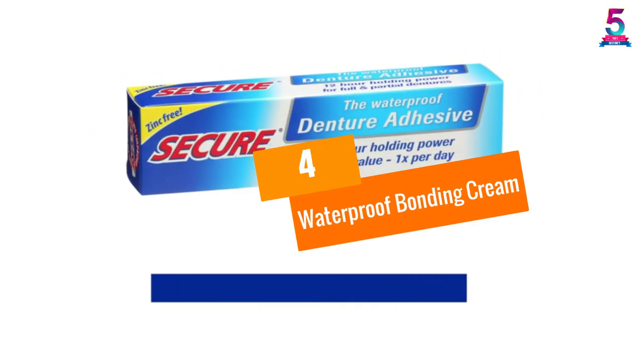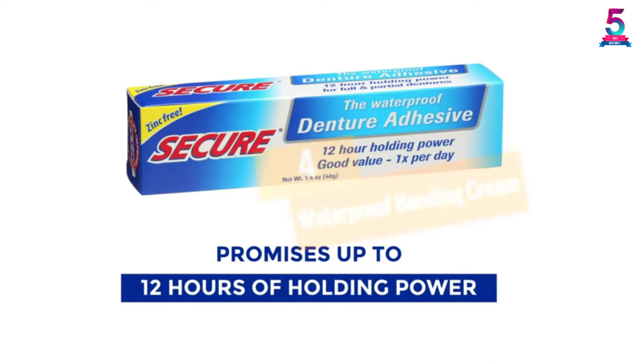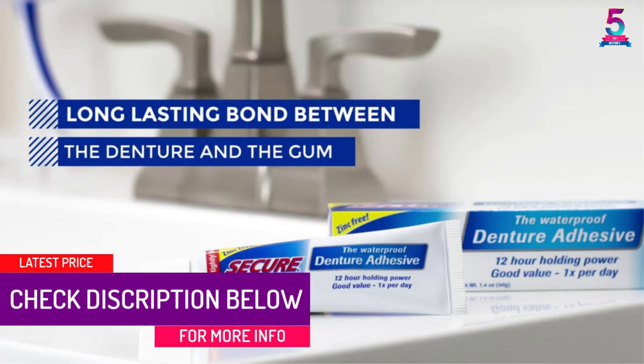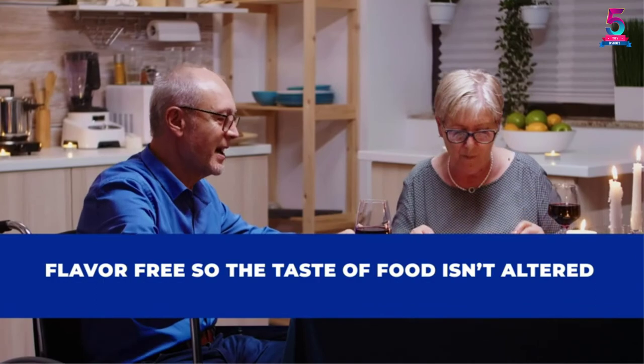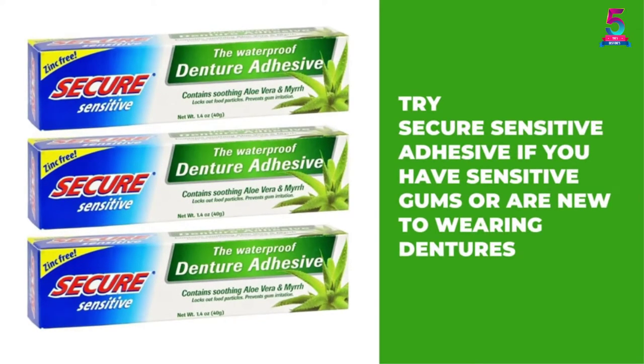At number 4: Waterproof Bonding Cream. You can have breakfast, lunch, and dinner with plates in with ease. Unlike other bonding creams in the market that last for a few hours, this one provides a secure hold to keep your dentures intact for up to 12 hours. For best results, carefully follow the instructions or you might end up with a sticky or gooey mess.